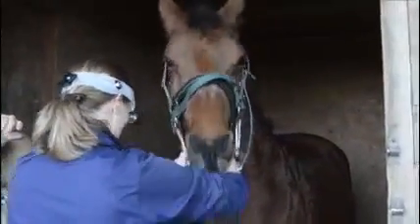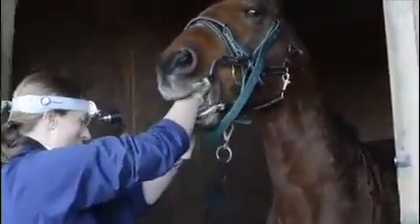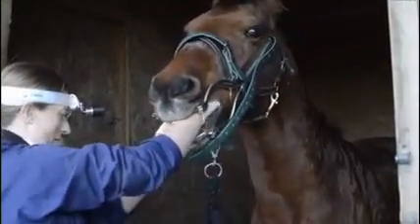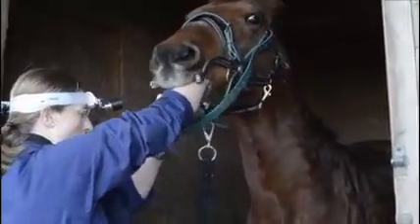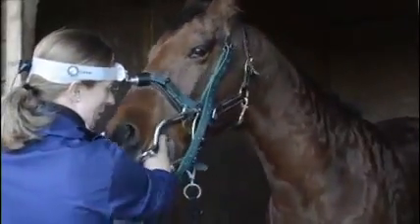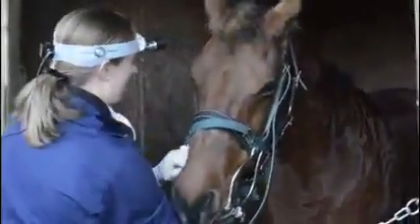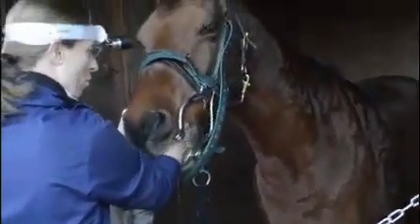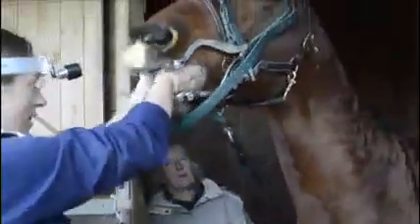We'll just have a feel now. I tend to have a feel along each cheek tooth row, so basically 4 rows and each with 6 teeth. And just see if I've got any gum disease that I can feel, or any loose teeth. And just feel the regularity of the cheek tooth rows basically. So I've got a few little points on the inside of our lower teeth, and a few little points on the outside of the upper teeth. And there's a previous fracture. He's lost about a quarter of a tooth on the outside of his upper left side.